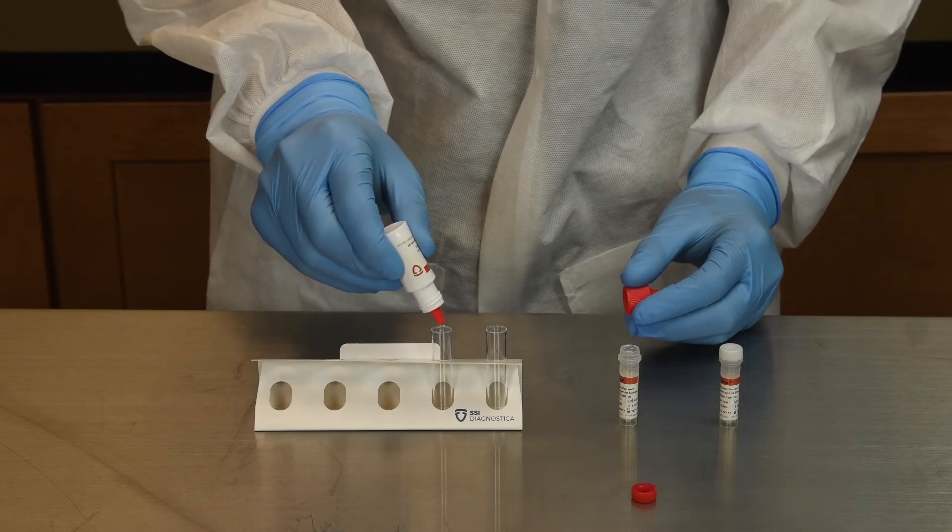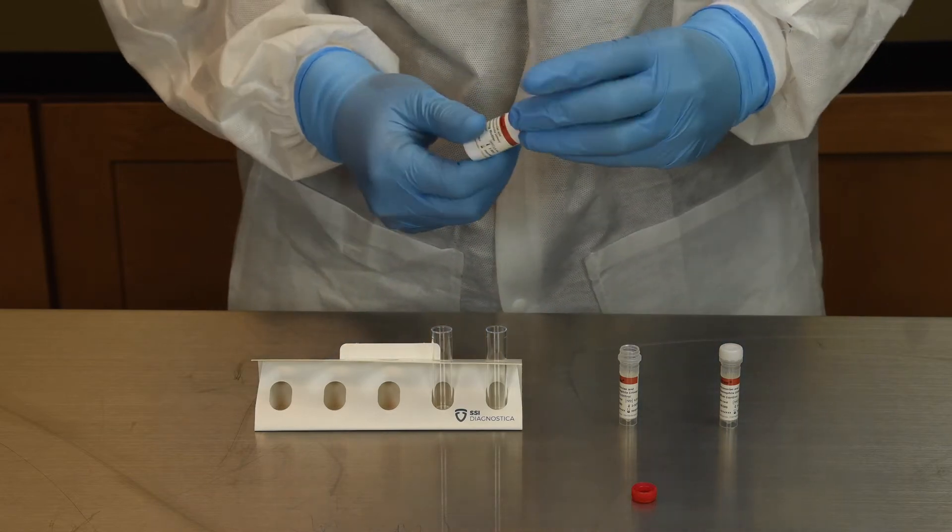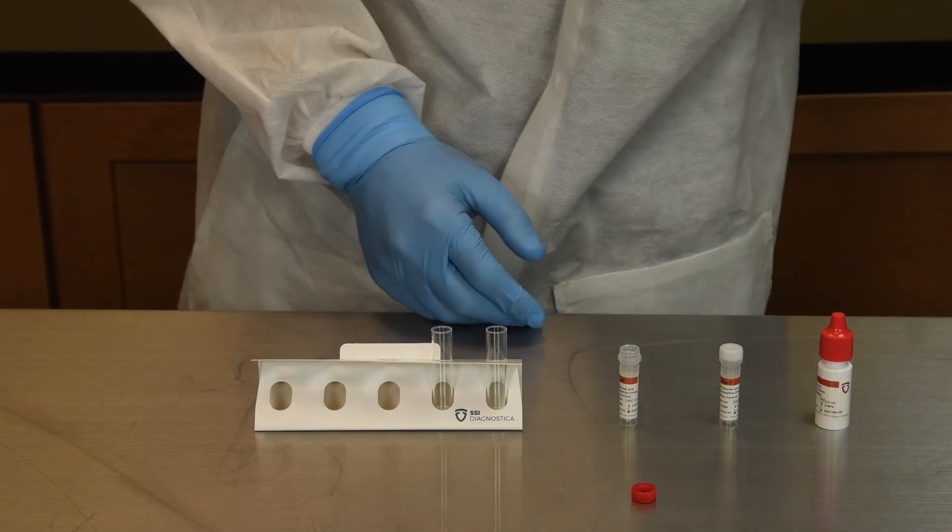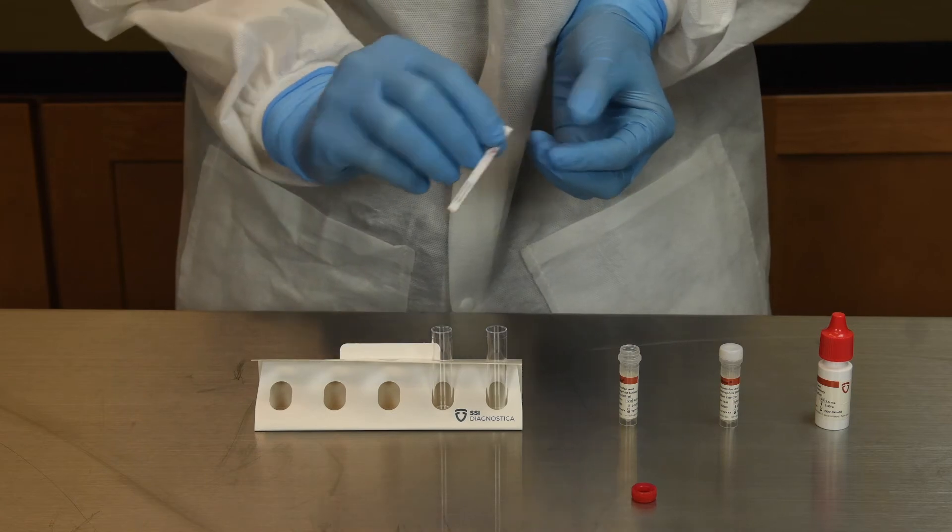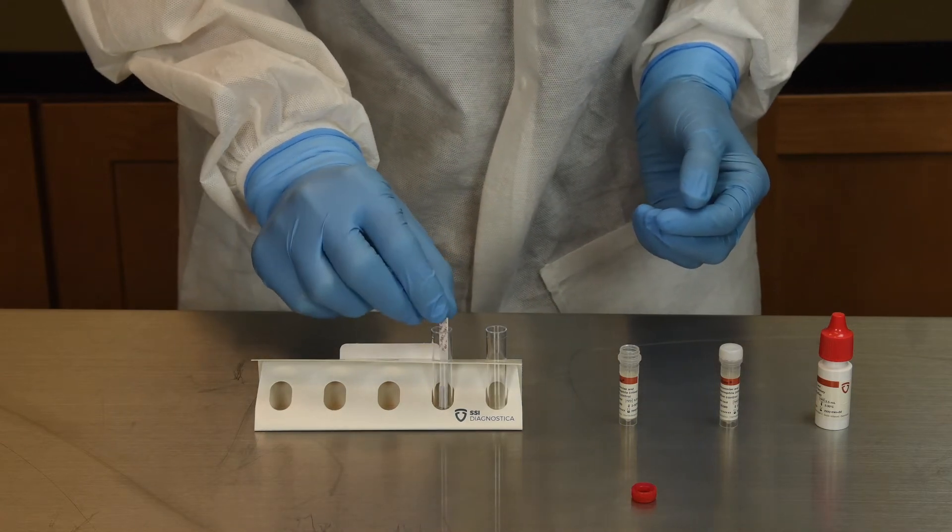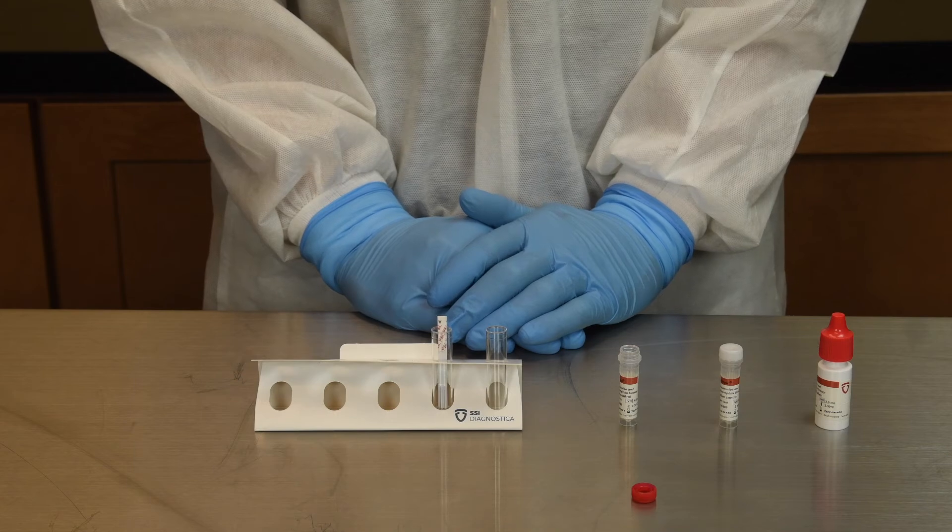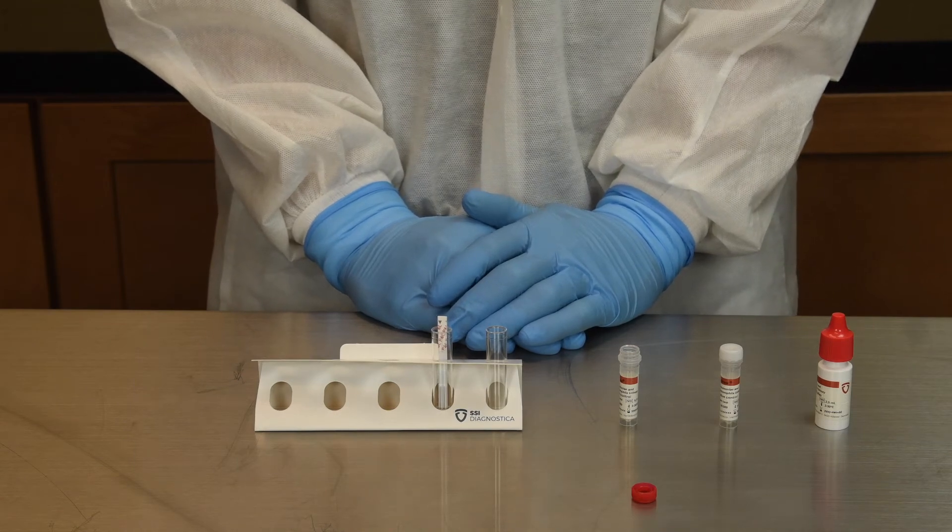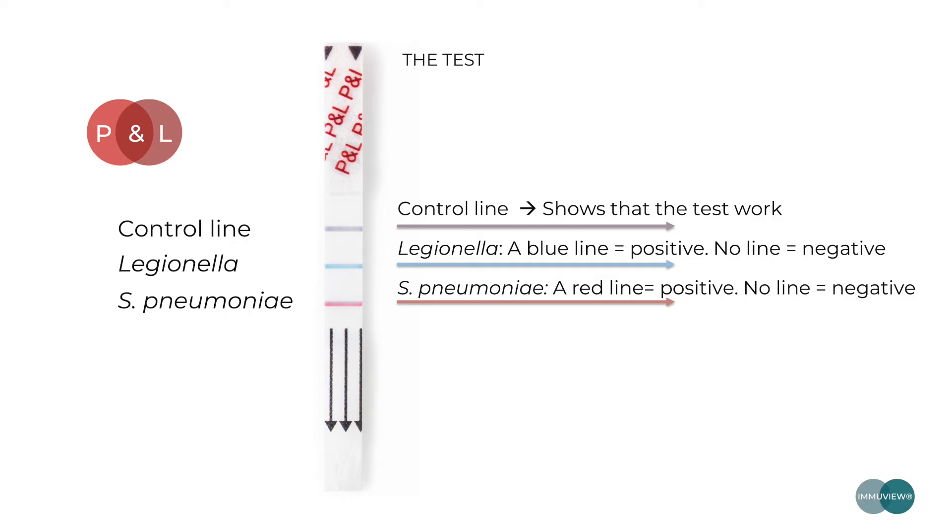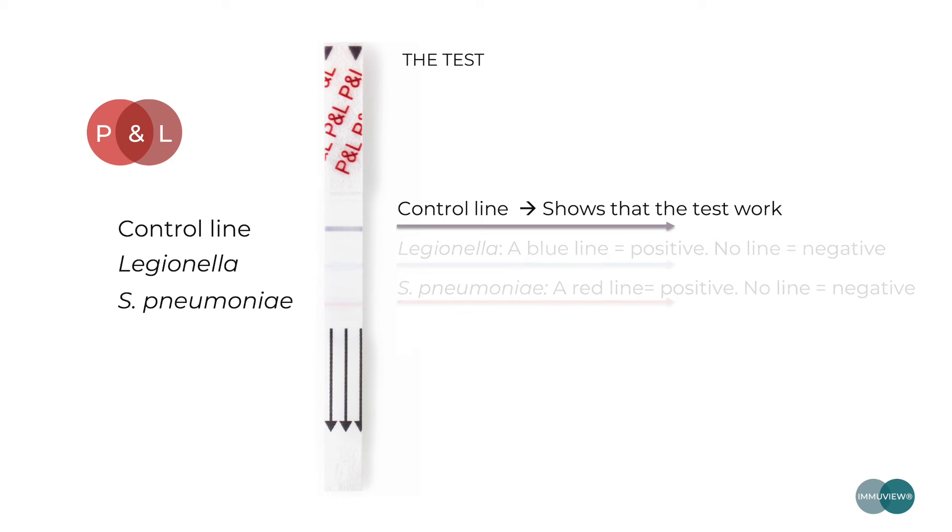The procedure for running a positive or negative control is identical to running a patient sample. Quality control should be performed in alignment with the product's instructions for use and your laboratory's internal quality control procedures. The positive control will show test lines for S. pneumoniae and L. pneumophila. The negative control will only show the control line.